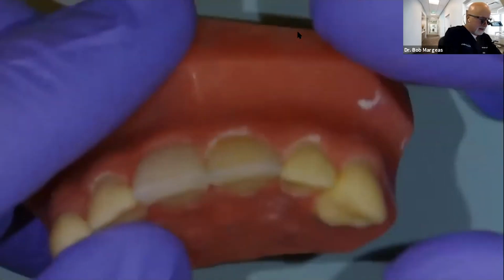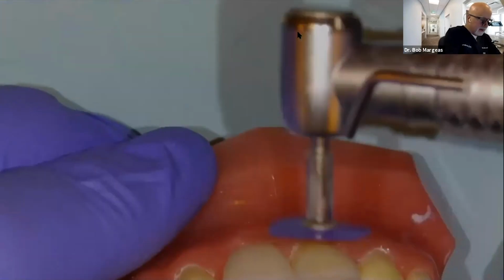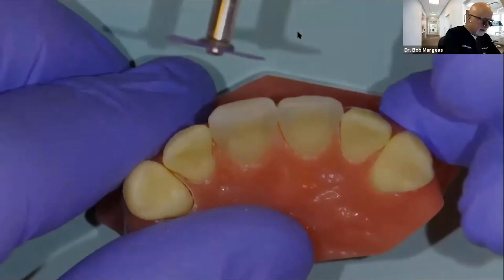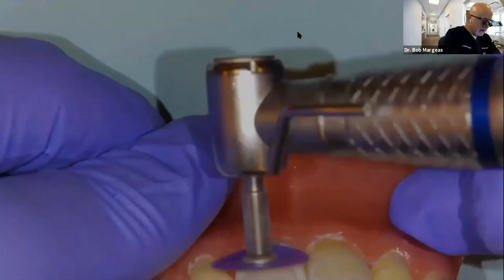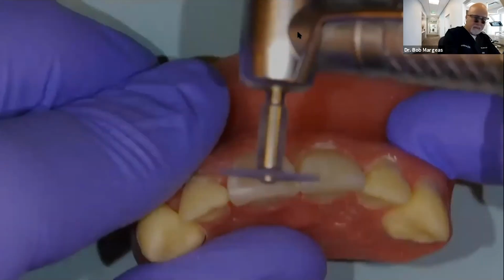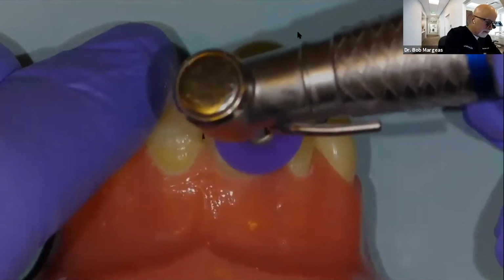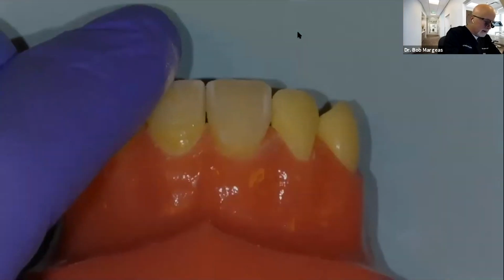Now, the next thing that I want to do is get the incisal edge back. So I'm going to use my disc here like this, bringing this back. And I go from the cervical to the incisal using my contour disc.